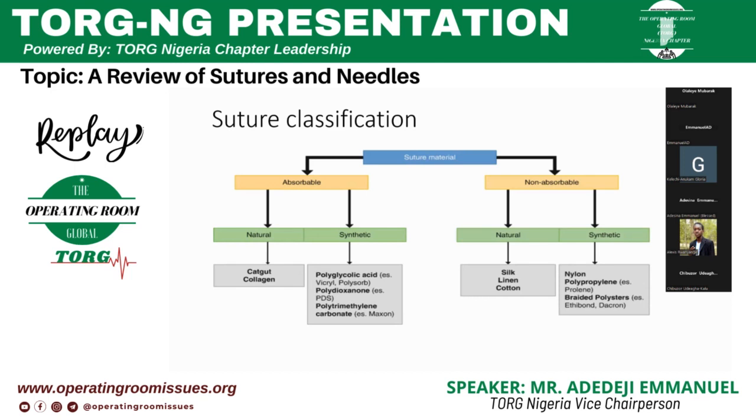But for the holding of tissue together, we expect that in the first 2 weeks the tissue's integrity is maintained with the kind of suture that we choose, so that the wound can heal in record time without wound breakdown, or, when the wound has to heal by secondary intention, it comes down with tissue reactions, fibrosis, keloid, and all of that.